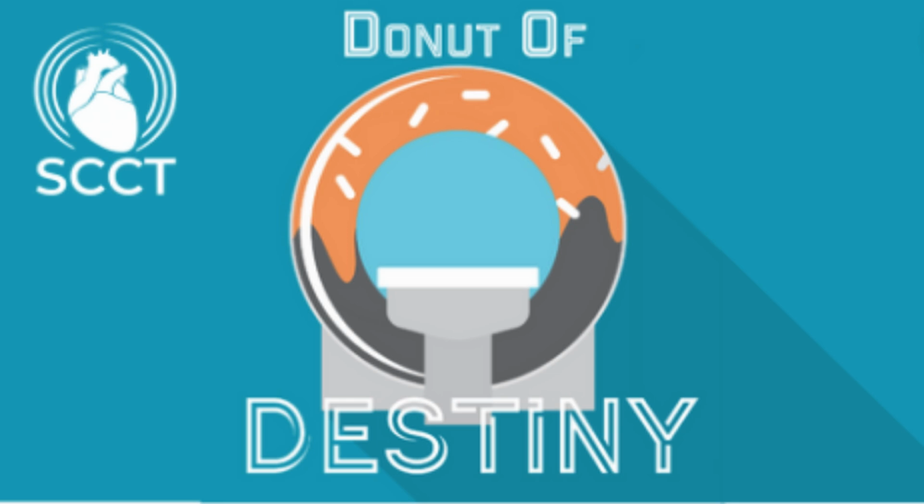Indeed, thanks to the dynamic CT perfusion, you can acquire multiple slices at multiple time points in order to describe the wash-in and wash-out of the contrast agent in rest condition and in stress condition through the myocardial wall.